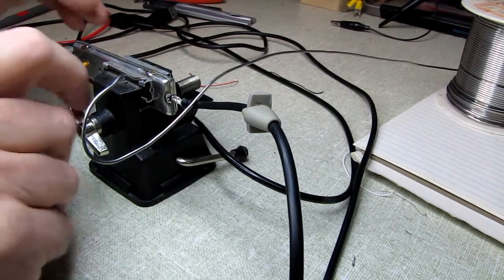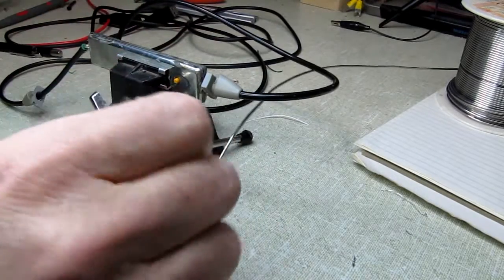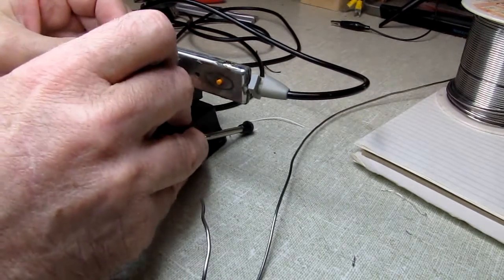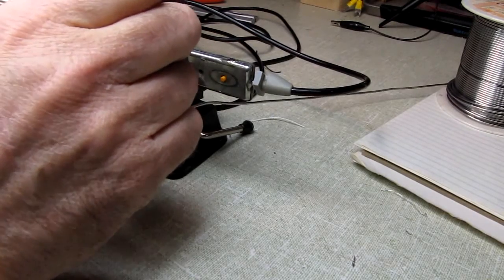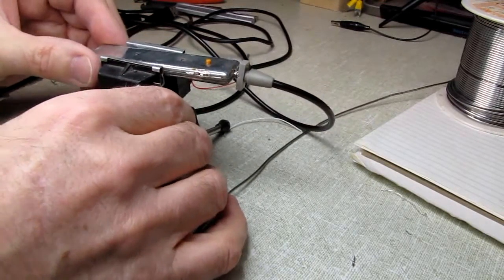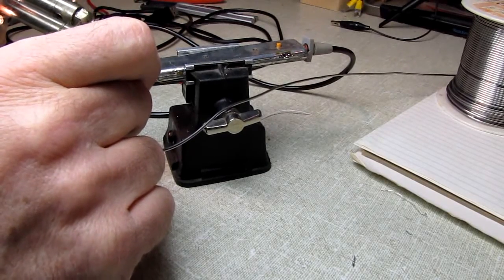I'm going to tell my sister, if this thing doesn't work, bring it back to me. And I just want to do a tear down of the imaging head if it doesn't work. But we're not going to do that now because it's hermetically sealed for medical reasons. And, you know, to keep it sanitary so everybody's old spit doesn't get down inside the thing. And I do have a radioactive source, a piece of thorium tungsten, which would probably show up just fine if I can get the thing to work. In fact, I'm going to see if she can get her hands on the software. The doctor might be willing to let me put it on my laptop to test these things. If I can get this one working, he just might be willing to let me have the software so that I can repair them in the future and make sure they're working before I send them back.